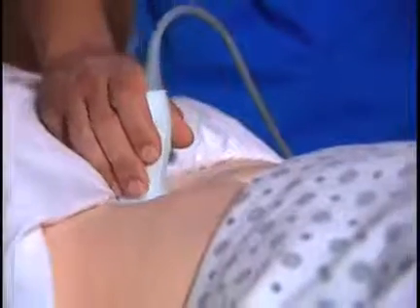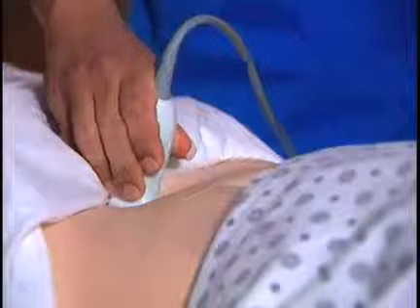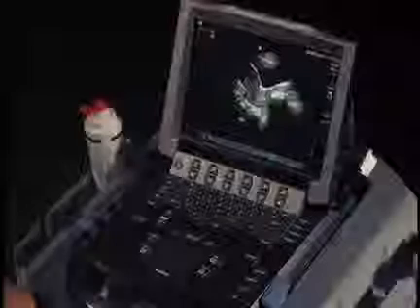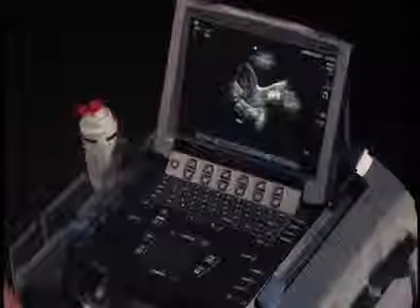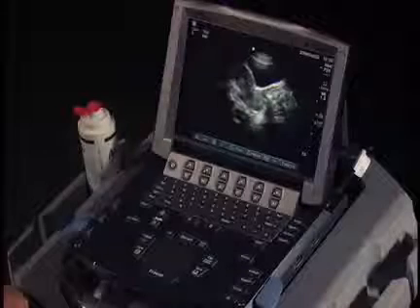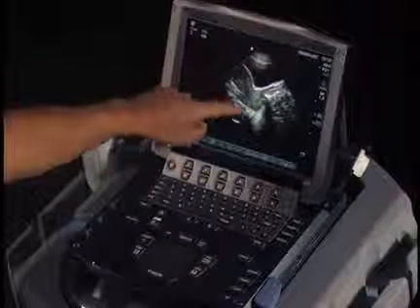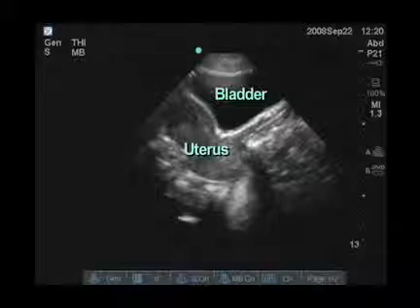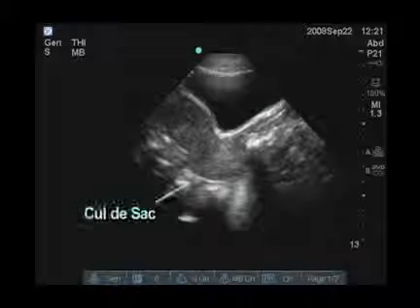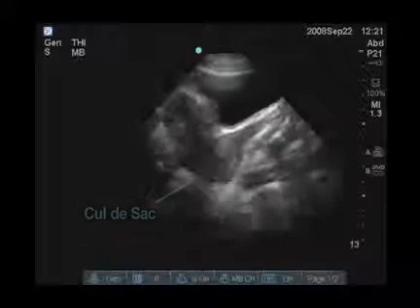We go just above the symphysis pubis. We're scanning now here sagittally, and some of the anatomic landmarks that we're looking at. At the very top of the screen is the bladder, which is an anechoic structure — fluid filled with urine. It's got nice walls around it. Just below that is the uterus, which is a pear-shaped organ. You can see it well-visualized because the bladder is full. And just below that is a potential space, the cul-de-sac, where we can look for small amounts of free fluid.